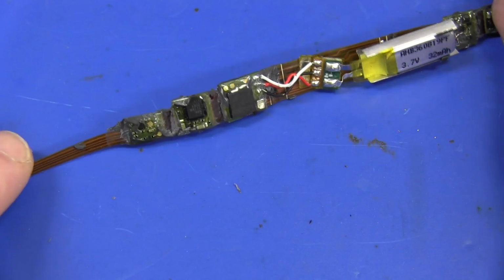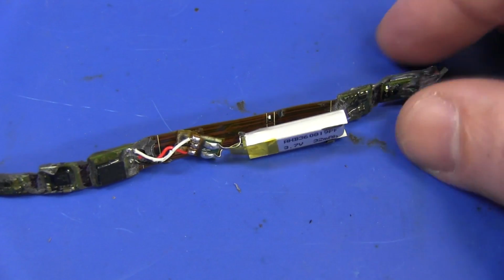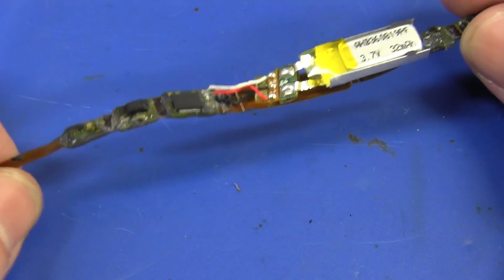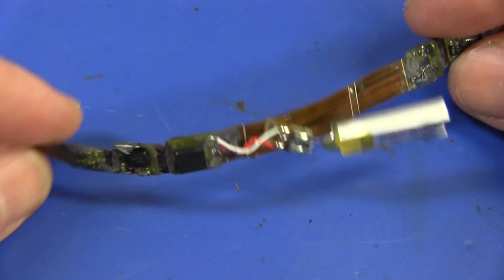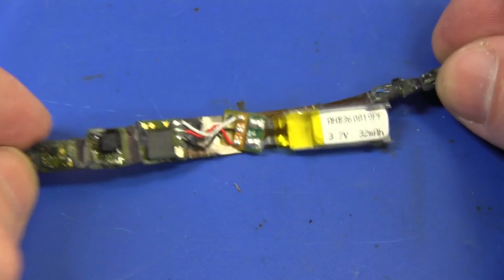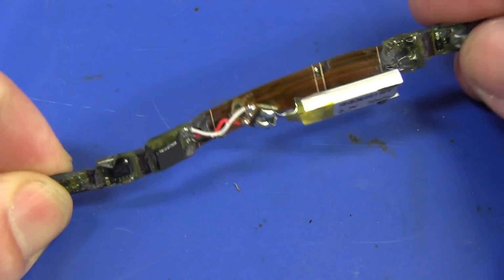So there you have it, folks. That's inside the Jawbone UP Pedometer, and that's rather interesting. It's not just a regular pedometer. It's the rigid flex structure that really makes these sort of things interesting from an engineering design point of view, because it's not easy to actually design all the logistics and construction which goes into building a rigid flex board like this.